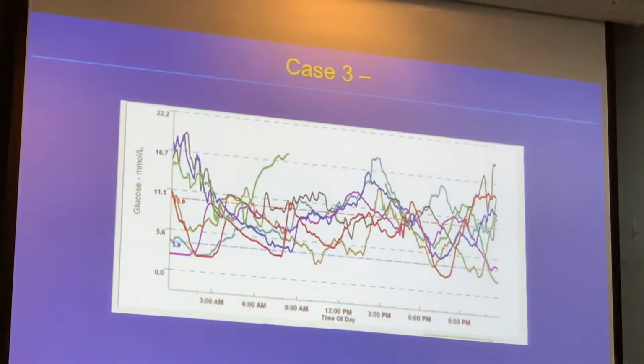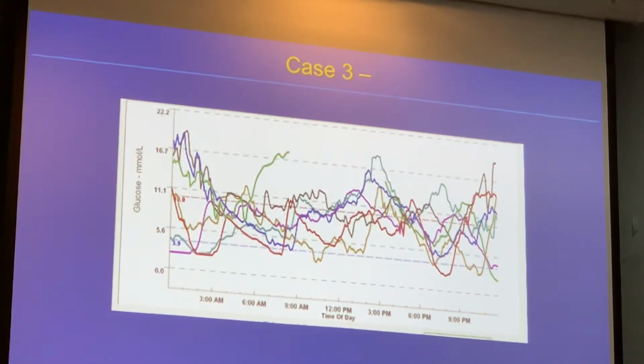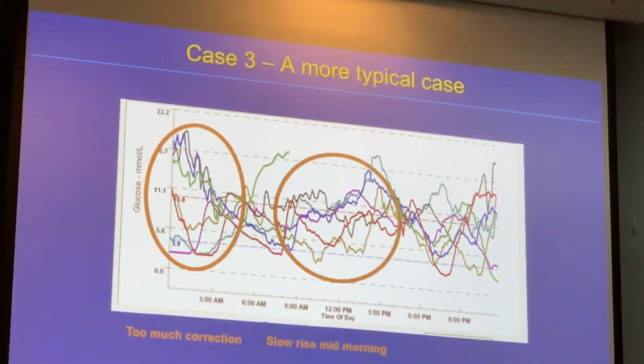So your focus would be really to know basically patient habits, exercise, time of the day, and then you will be suggesting that you can reduce overnight basal and then increase the prandial insulin at lunch and dinner, right? So this is just a major thing that when you talk, definitely you're not wrong, and you are a safe doctor, and the examiner will be compelled to pass you, because this is what he's actually showing.